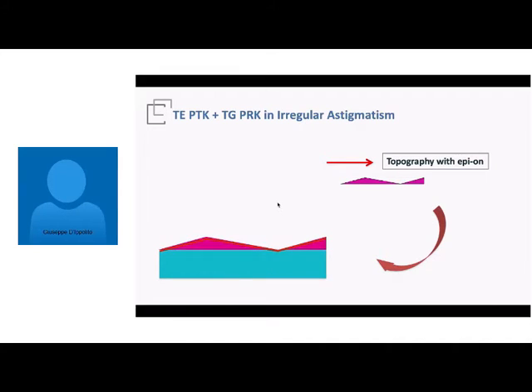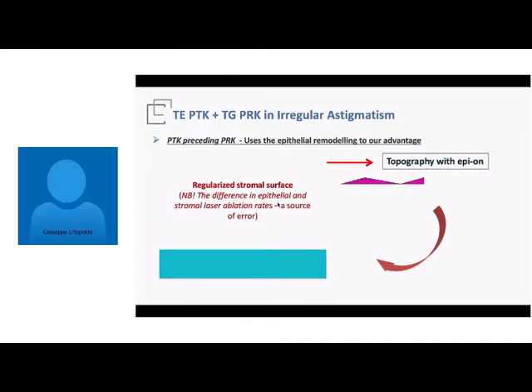And then, of course, we can safely use topography guided custom ablation plan and achieve regularization. But of course, there are many practical issues here, and not everybody achieves that, but this is the right way to go, at least in theory.